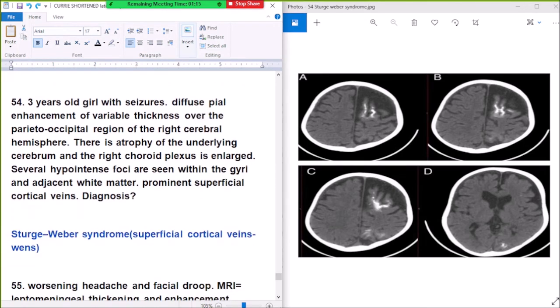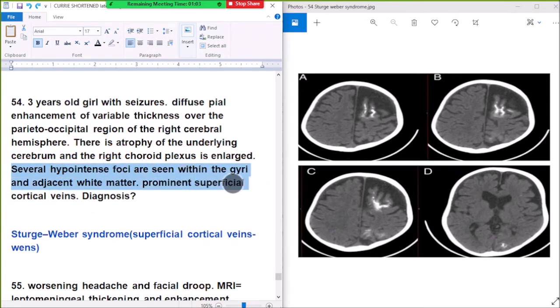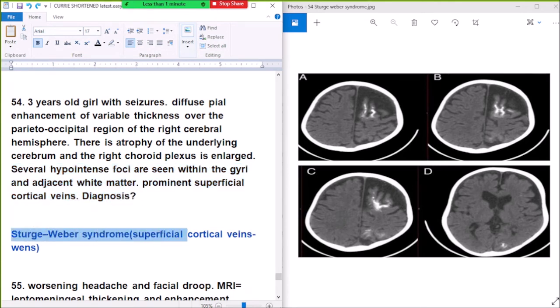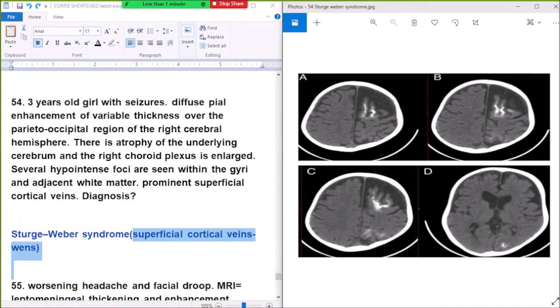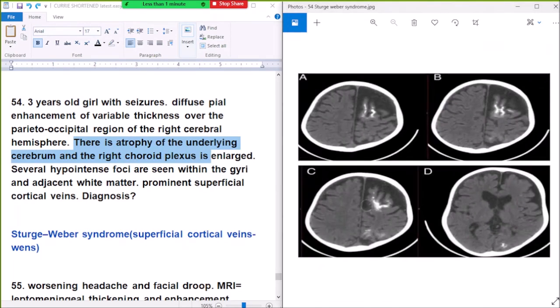Question number 54: Sturge-Weber syndrome. Diffuse pial enhancement of variable thickness over the posterior region of the right cerebral hemisphere. There is cerebral atrophy with the right choroid plexus enlarged. Several hypointense foci are seen within the right gyri. Prominent superficial cortical veins are also seen, which is characteristic of Sturge-Weber syndrome. Diffuse cortical calcification is also present.